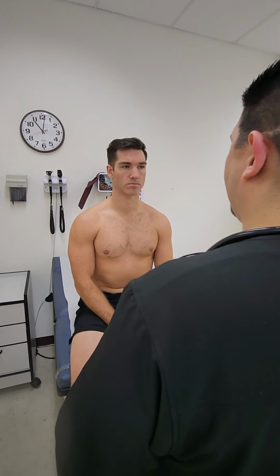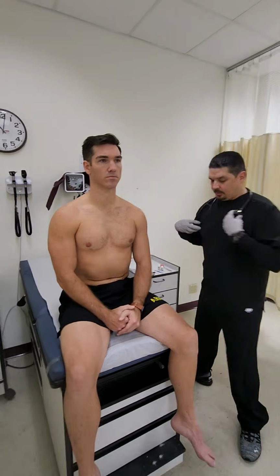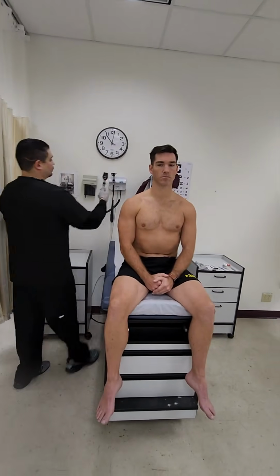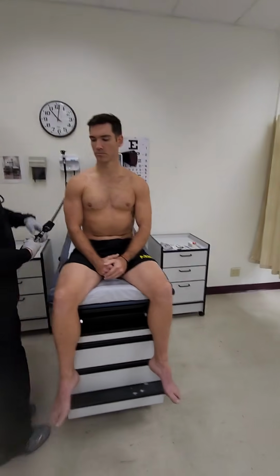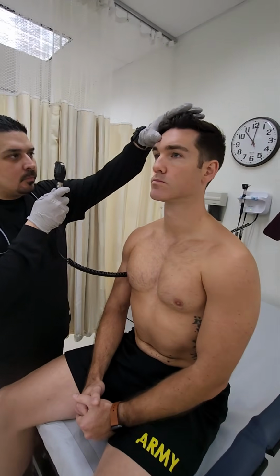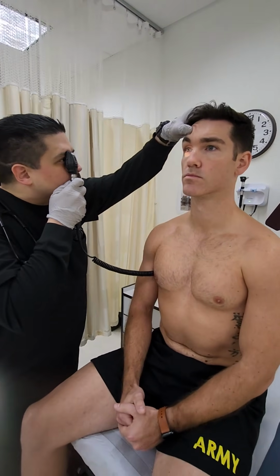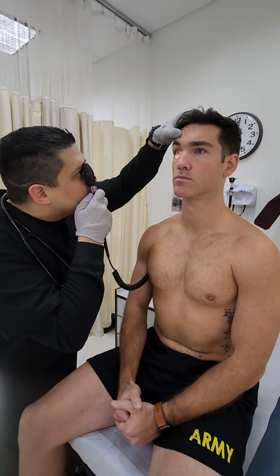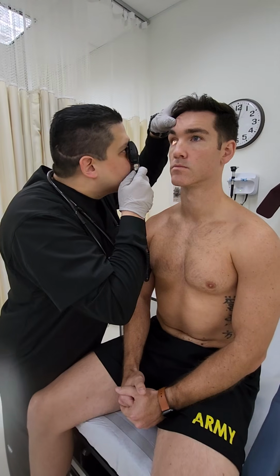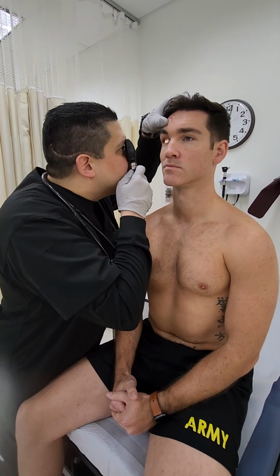Now begins the ophthalmoscope examination. Ophthalmoscope exam technique. Use same eye as patient for examination. Brace free hand against patient's head or shoulder and move in close enough to visualize fundus. Look at the light.